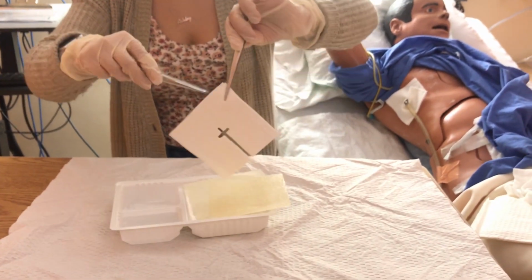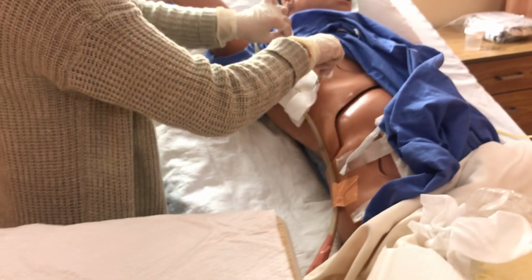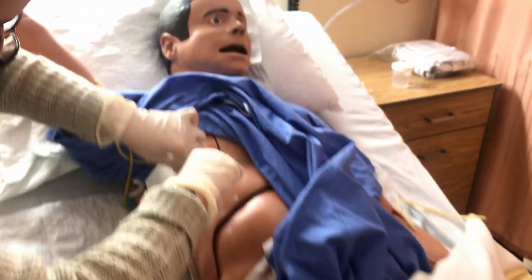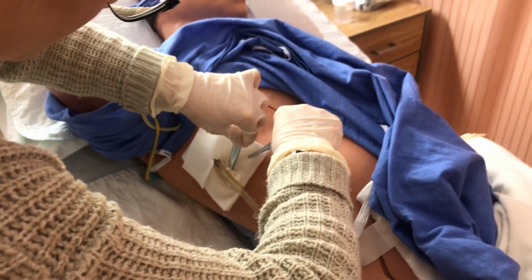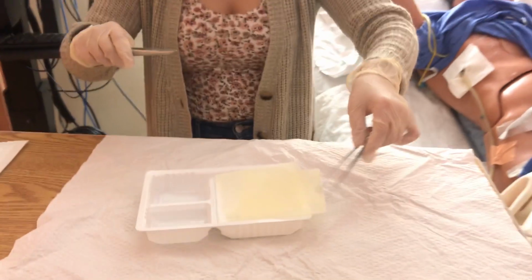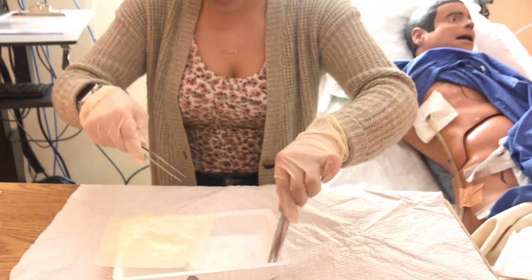So that's one. And then in a different direction. And then grab one of my 4x4s to place on top.